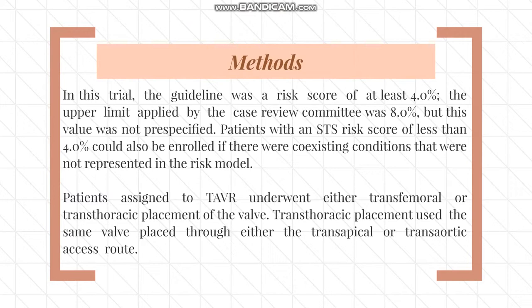Patients assigned to TAVR underwent either transfemoral or transthoracic placement of the valve. Transthoracic placement used the same valve placed through either the transapical or transaortic access route.